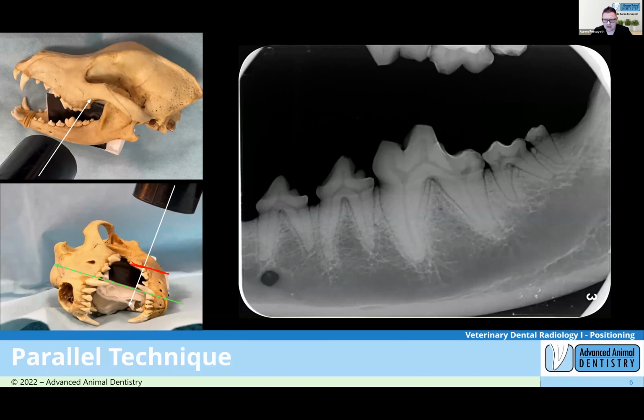Karen's got a question here about 311 and 411. They can be hard to get in there, and I find them difficult to get as well. Even if I'm using a size 2 plate, I think, oh, this is easy, it should be right there.